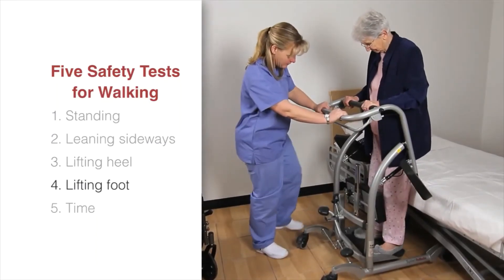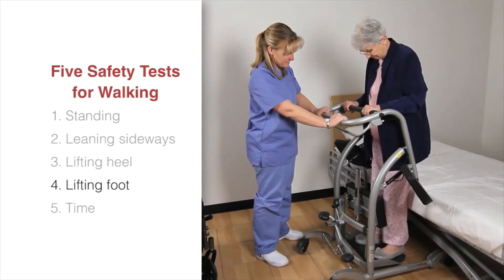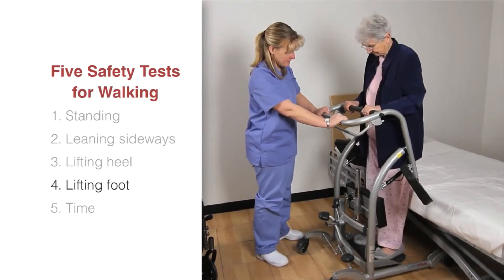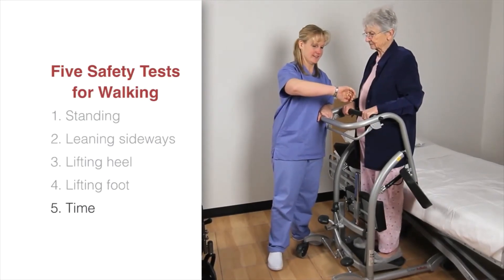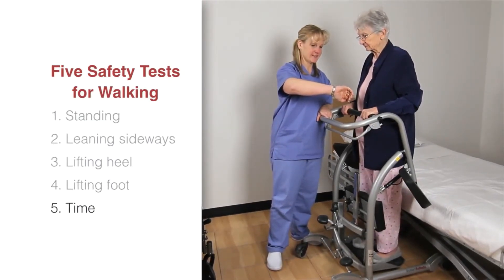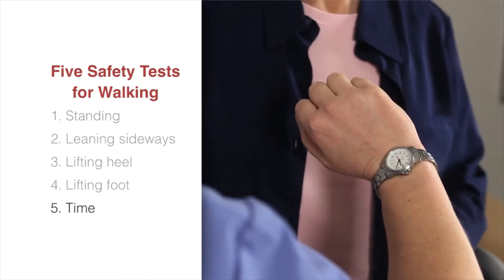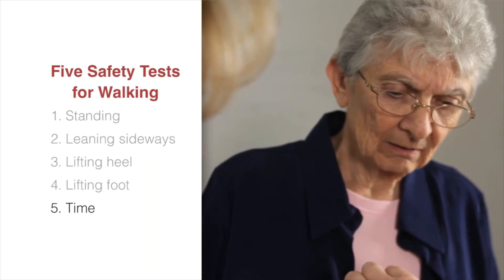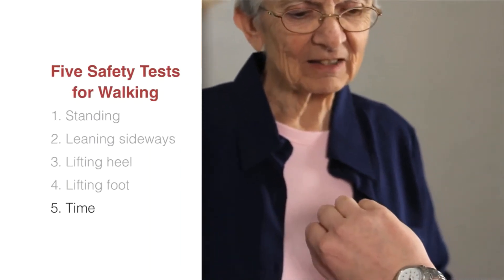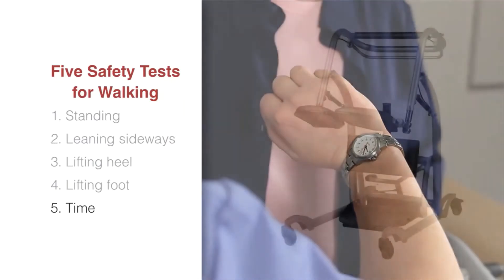Check if the patient can lift their feet left, right, left. If this is okay, go to the next test. The final test determines how long the patient can bear weight, assessing not only strength and ability to bear weight but also endurance. This test helps determine the patient's ability to walk for a certain duration of time by assessing the maximum time they are able to stand and bear weight.